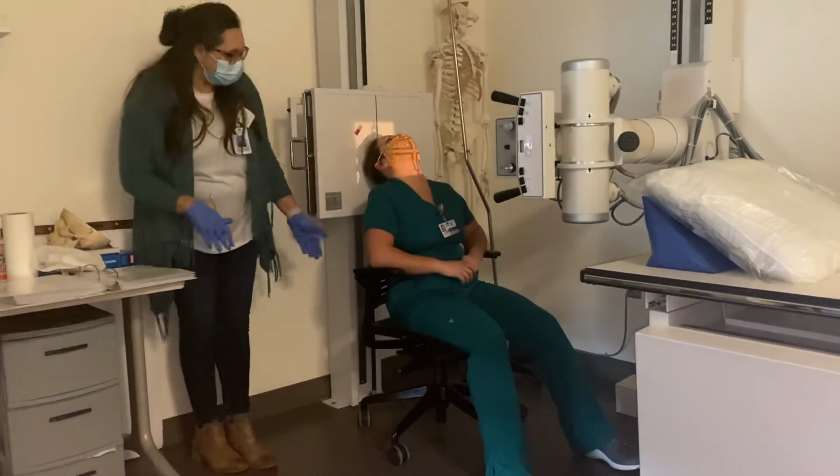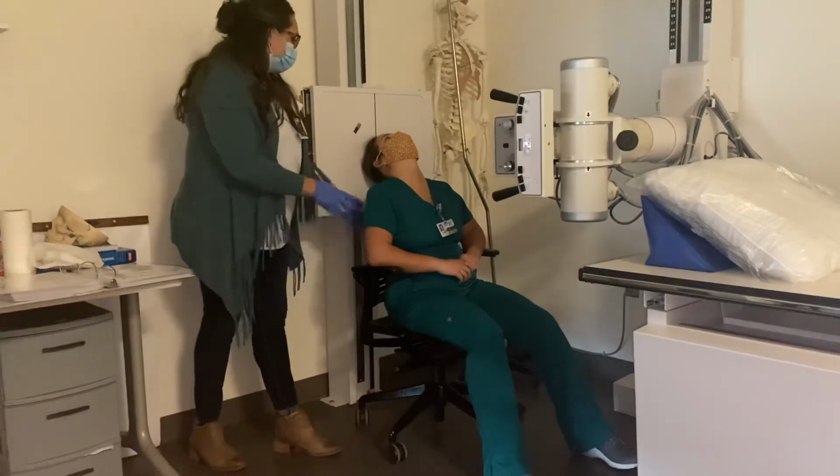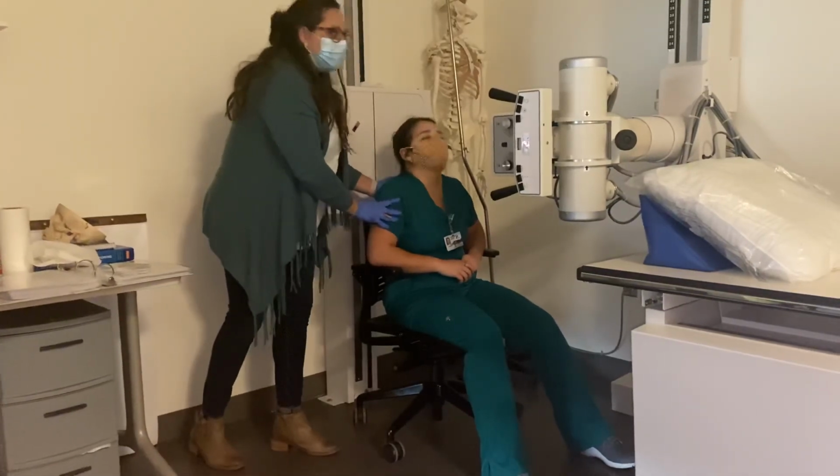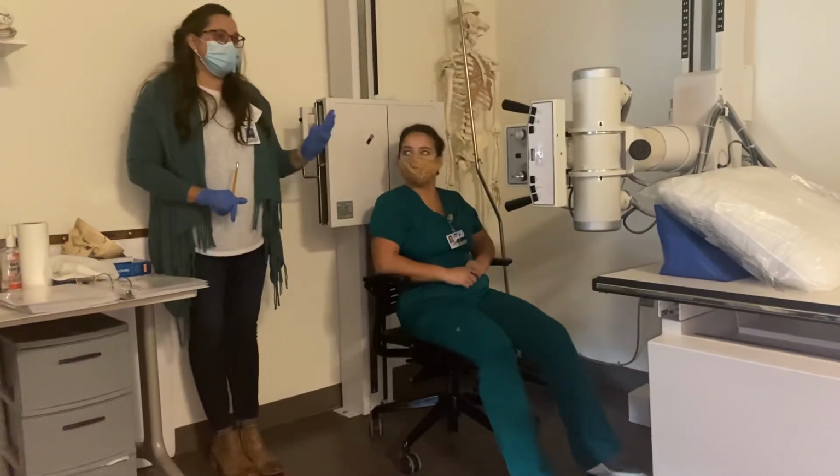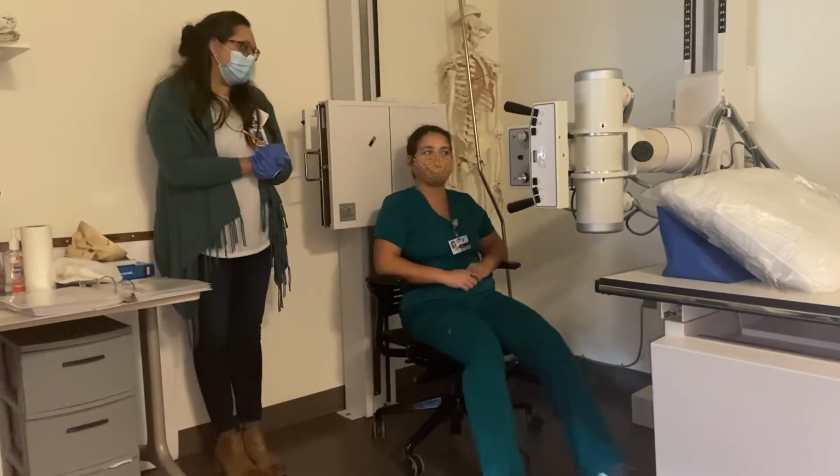So then take your patient's picture, hold your breath, don't move, and then when you're done, help them get up because it's very uncomfortable for your patient. Make sure you're as set up as you can possibly be before you bend them up because it's not very comfortable.